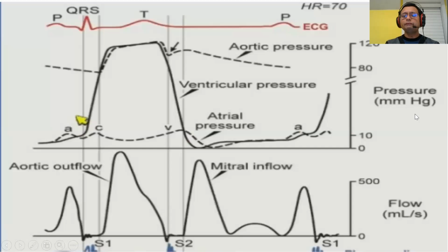Okay. In order to understand diastolic dysfunction, and this is a detailed diastolic dysfunction talk, it is important to see hemodynamically what we're talking about. So look at the image here. This line here is the left ventricular pressure. This is isovolumetric contraction, this is the ejection period, this is isovolumetric relaxation, and this is the relaxation period.